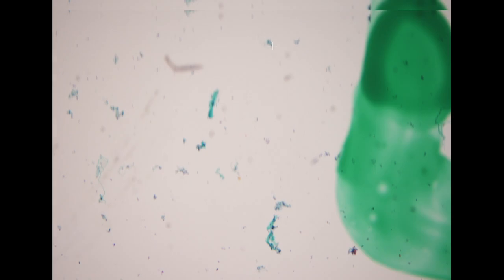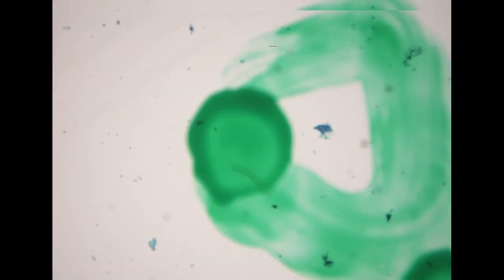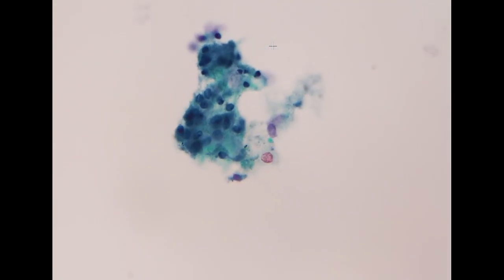If based only on these, I would say this is suspicious for adenocarcinoma. However, because we had the biopsy specimen and it has already been signed out as adenocarcinoma, I think this is representative of a relatively well differentiated adenocarcinoma with a stromal type of invasion pattern in our cytology specimen. Okay, so that's all for the cases today.